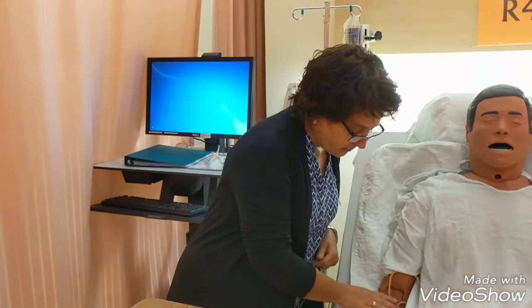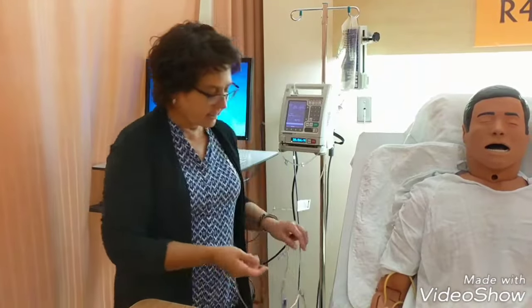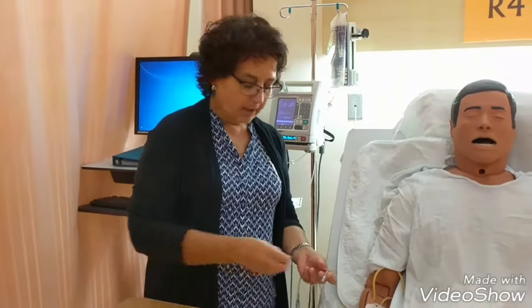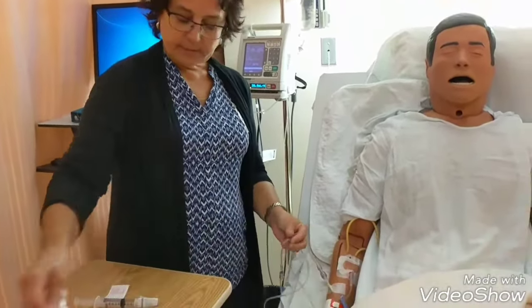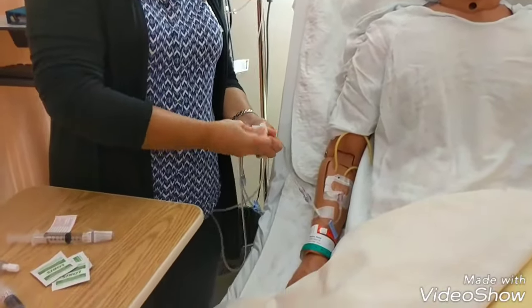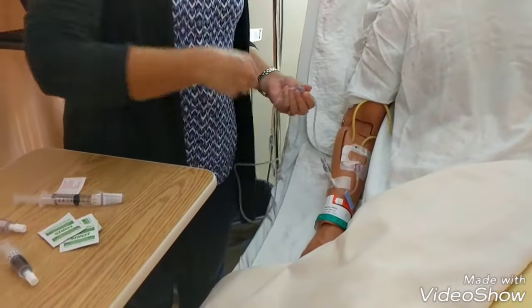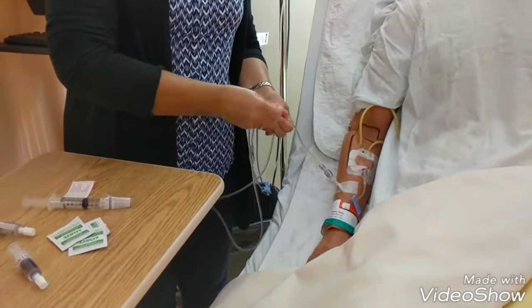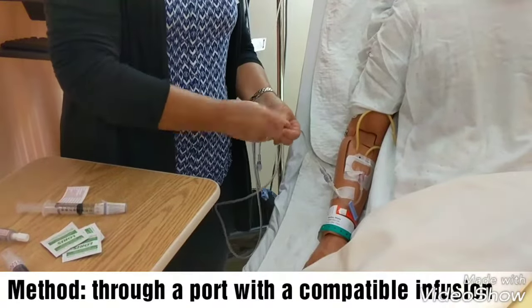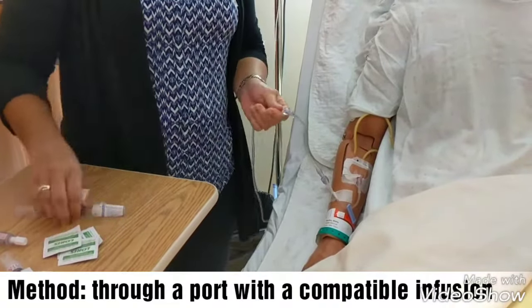My IV line is running, my site looks good, it's infusing well, it doesn't look like it's infiltrated into the skin. I'm going to alcoholize my port. I've done my checks — I've done my three checks — made sure this is the right patient and my right reasons for giving the morphine. I'm going to leave my IV running, it's still infusing. I'll let it dry for 30 seconds.